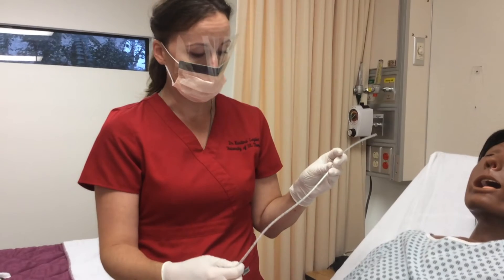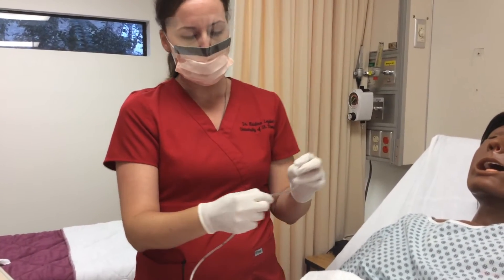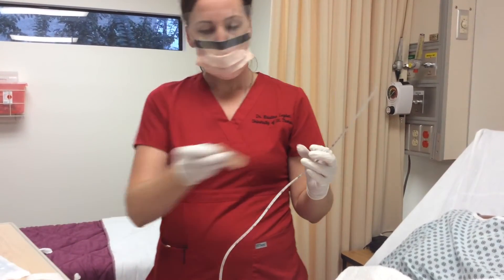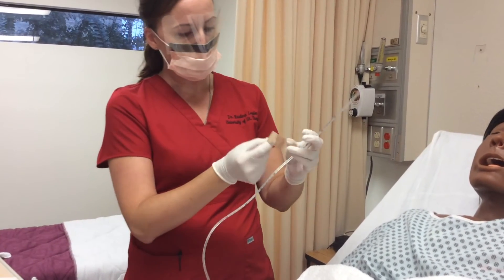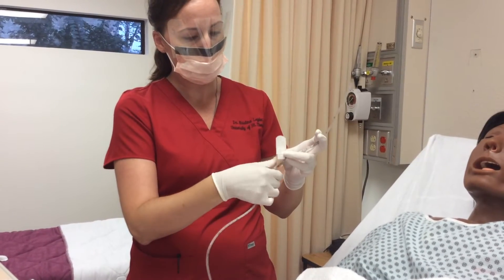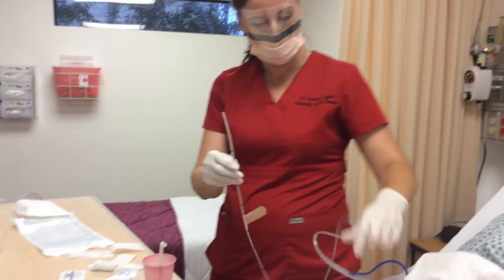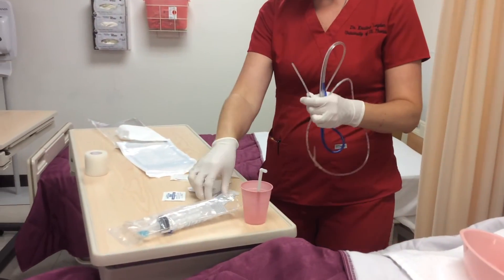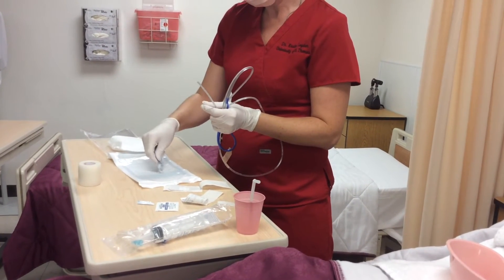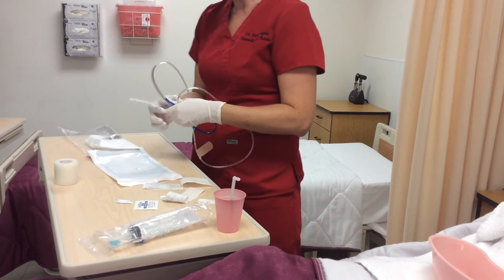I would tape or apply the end of my band-aid to that area and then insert accordingly. For the purposes of this demonstration, this tubing will only go into the mannequin at about 30 cm, so I will tape it there so you can see how to use the tape for proper marking and applying it to the patient's nose. At this point I can lubricate, and I do want to be quite generous in my lubrication.